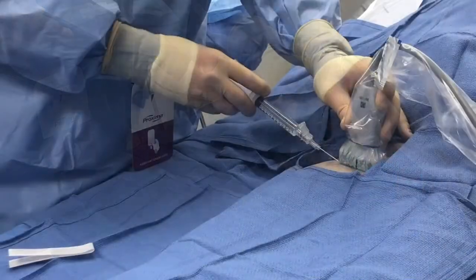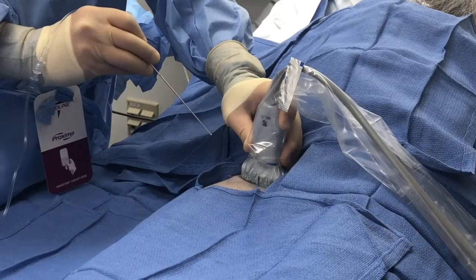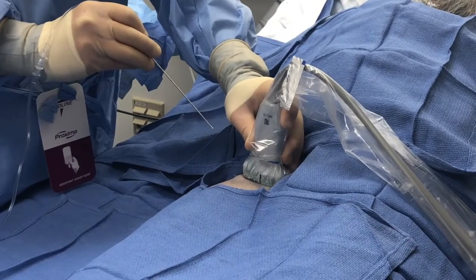Infiltrate the dermis of the planned entry site with 1% plain lidocaine. Connect the tubing needle to the tubing and have an assistant flush anesthetic to remove all air bubbles. We use 40 cc's of 0.2% ropivacaine.